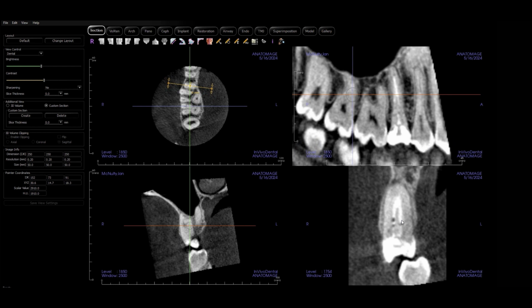What is left, if you do good obturation with warm vertical or carrier-based obturation, will be the proper amount so that you get very little, if any, puff. There's a lot of controversy over whether or not the sealer puff is indicative of clinical success or not. Topic for another day. I personally love a very small puff to confirm apical patency. Tells me that I cleaned everything out, but not too big of a puff that we bother the biology around the apex. Big puffs are not necessarily what we want anymore.